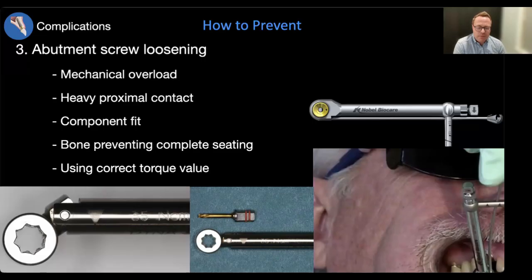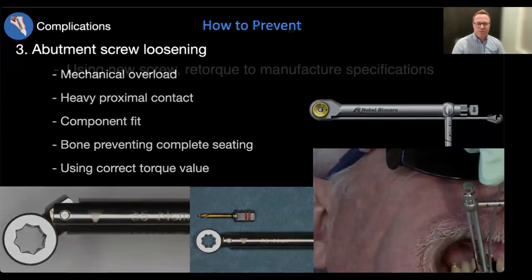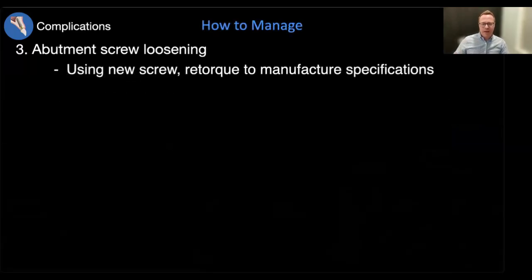And the problem with some of those, not all of them by any means, but some of them, if you think of all the sterilization cycles that you may go through, there's internal springs and things inside of this torque wrench that may get corroded. Maybe you lose some of that resistance that's needed, and so it may not apply the torque as expected. So just something that we need to keep in mind.